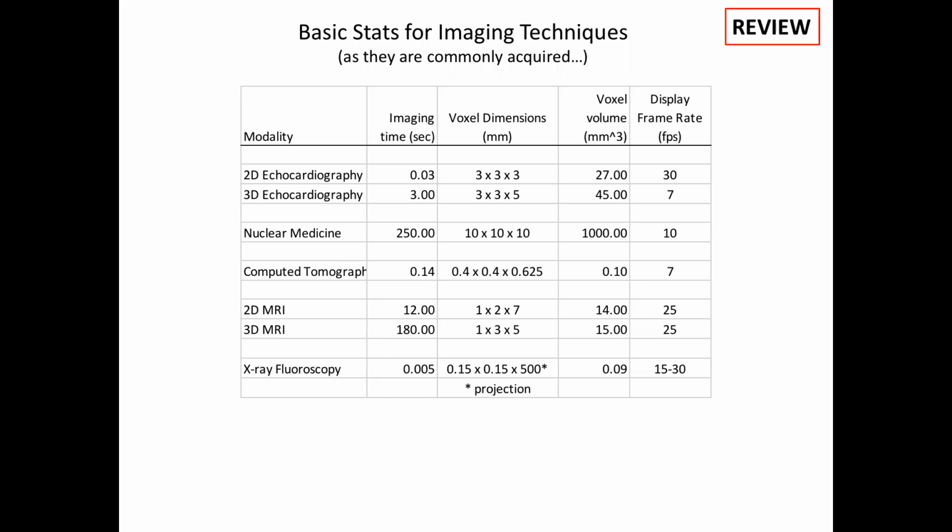You can actually tell that your eyes are sampling with a specific sampling rate, because when you drive on the highway and you look at other wheels on cars that have spokes, you'll see sometimes the spokes will be slowly moving backwards, or they'll be stationary or slowly moving forwards. That aliasing tells you there's a beat frequency between your sampling rate and the rotation of that object, right? And so if you say, oh, I'm going to do 100 frames a second, when you put it up on the screen, you're not going to see anything different than you did at 30.